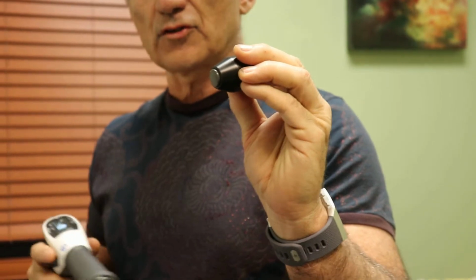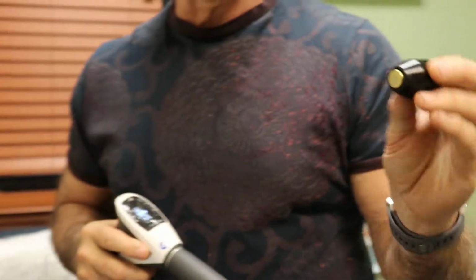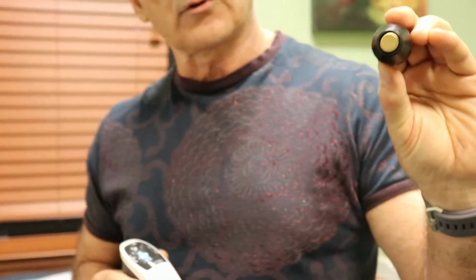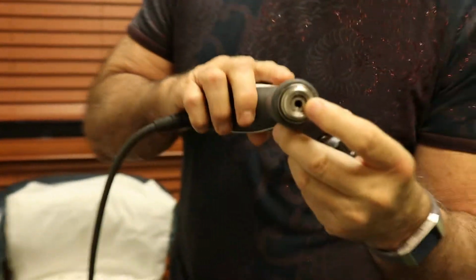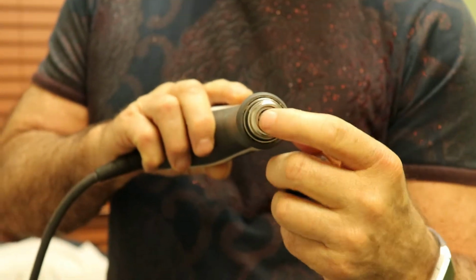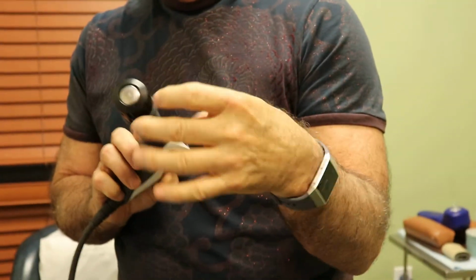We do not have to use a gel. On the other one, we use a gel just to absorb or prevent friction as I move the head. And the final one that I have, they have the other ones here, but these are the three main ones I use, is a gold tip, and this one goes deep into tissue for chronic pathology in those structures. So again, here is the hole through which the little pellet, looks like a little bullet, actually bangs into the surface of this, which is again creating this acoustic energy, eventually from kinetic to acoustic energy.